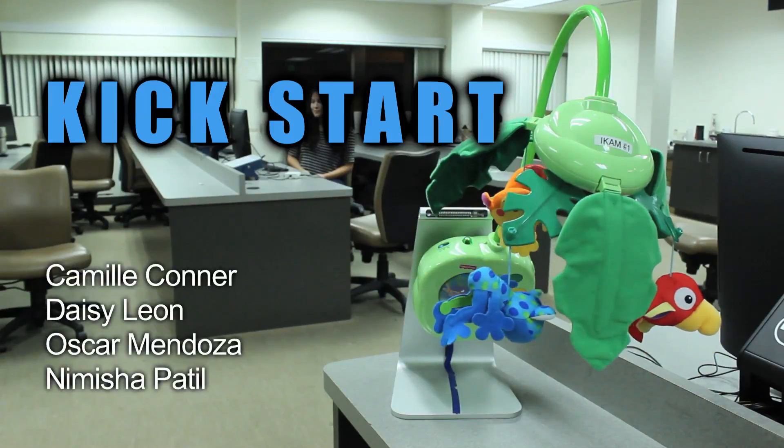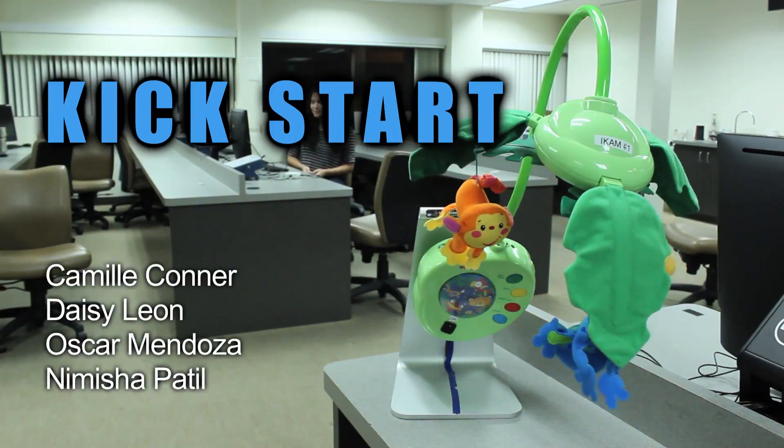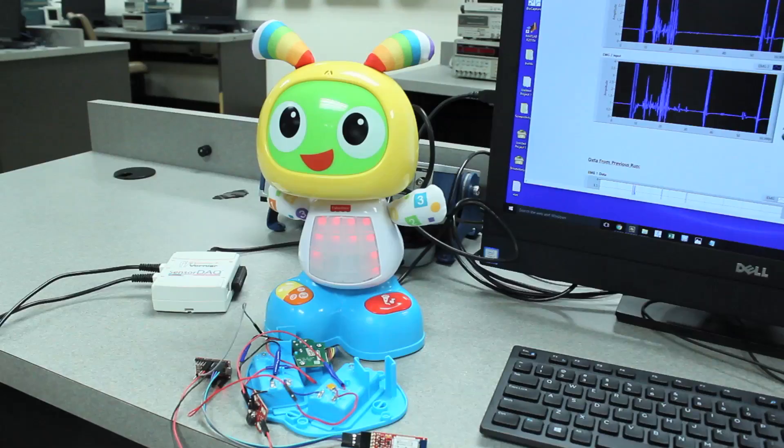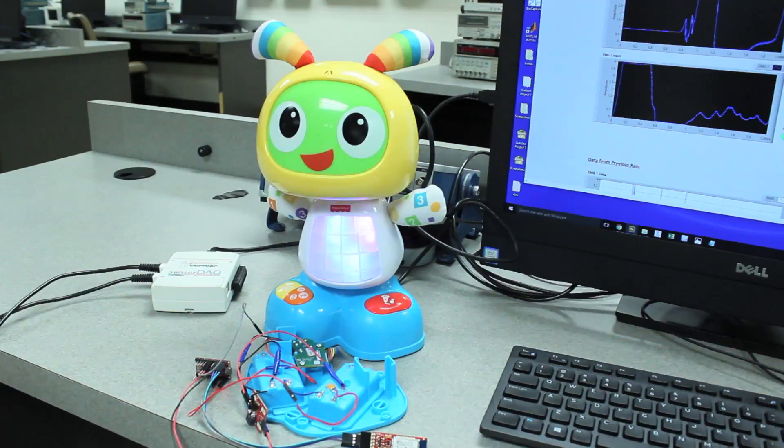Kickstart is a rehabilitation system for infants affected by cerebral palsy. Usually these infants do not move their leg muscles in the correct pattern. However, to help this, Kickstart provides them with positive reinforcement whenever they move their muscles in the correct pattern. When they do so, music plays from the computer and a toy also activates to let them know they're on the right track.